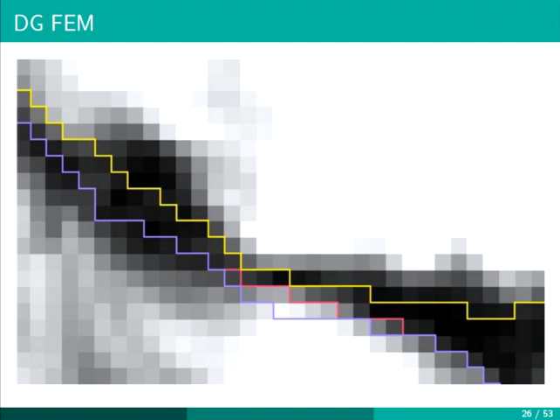In the purple, we see the outer skull compartment representation. And we can see that the purple line is generating some errors. In these points here, the segmentation is failing because compartments that belong here to the skin are included in the skull, and we want to avoid that.